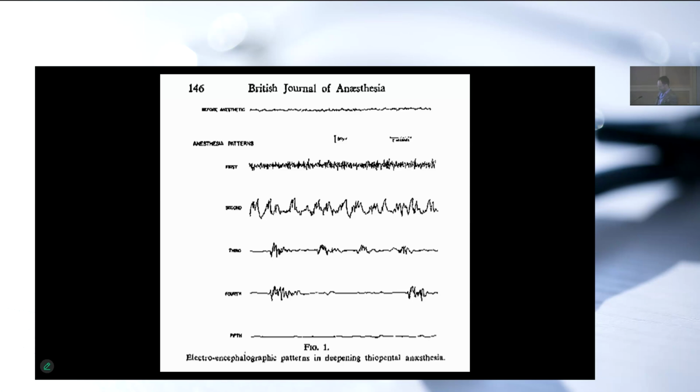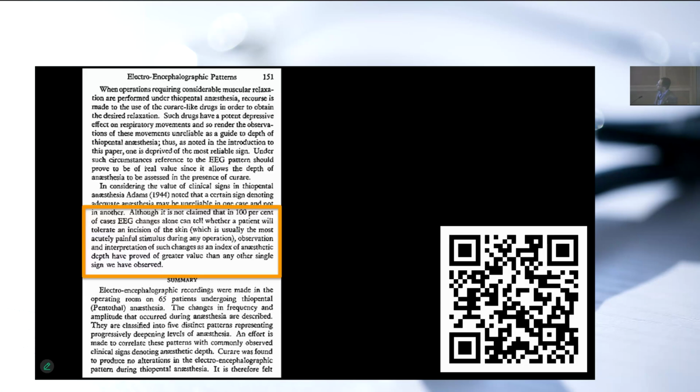They said, hey, it's possible to get in any of these things in some state of anesthesia. And so the interesting thing was all of these are acceptable states of anesthesia, but clearly there was a neurophysiological difference between all of them. They kind of arbitrarily divided them into 5 stages, but it need not necessarily look that way. In fact, these days we would collapse these down into degrees of burst suppression, and we would lump this into it as high-grade burst suppression. So we would have 3 grades now, but regardless, they knew that there was a difference.